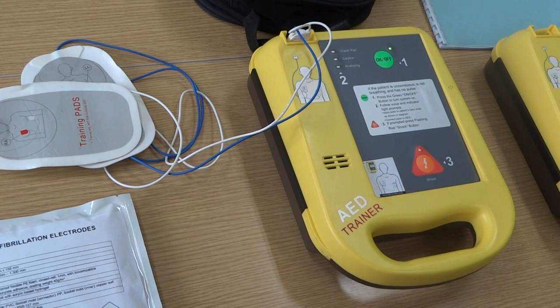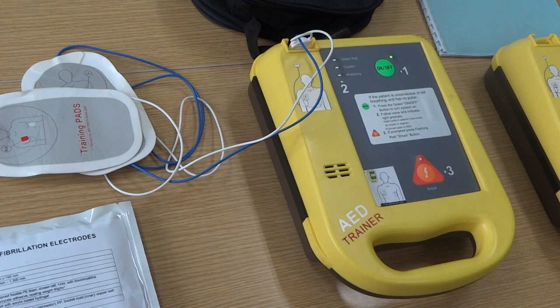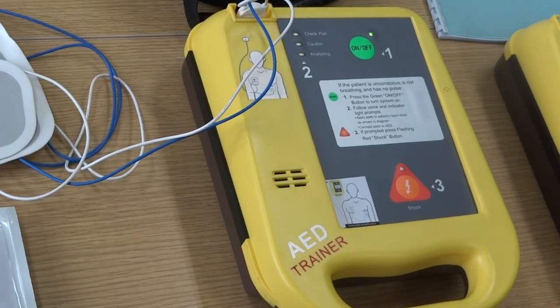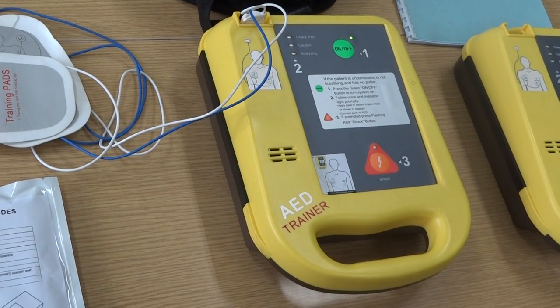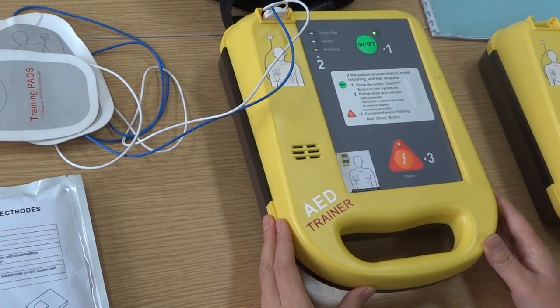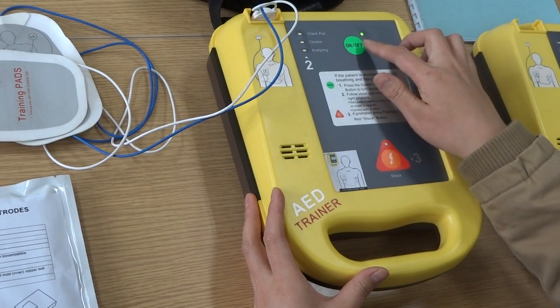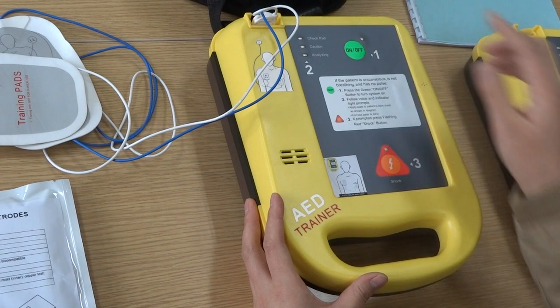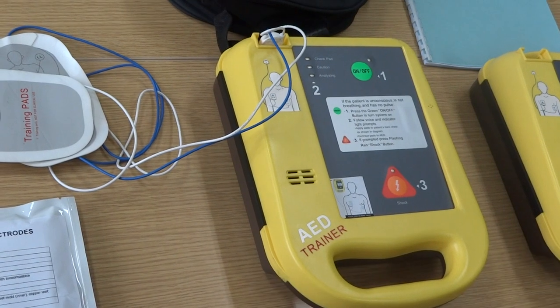The emergency staff should follow this rhythm to perform CPR on the patient until they determine the patient is okay, and then the whole process will be over. To turn off, press the green button for two to three seconds. That is the whole process of operating. Thanks for using our device — have a nice day!